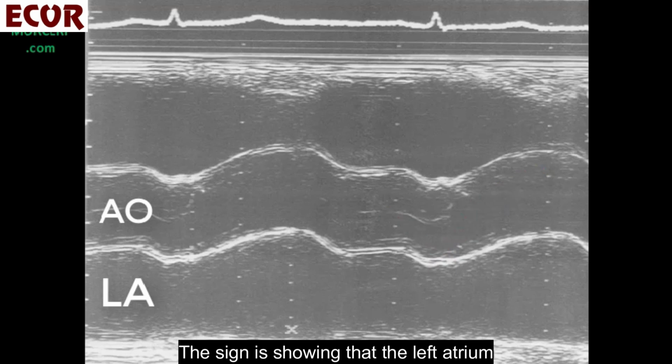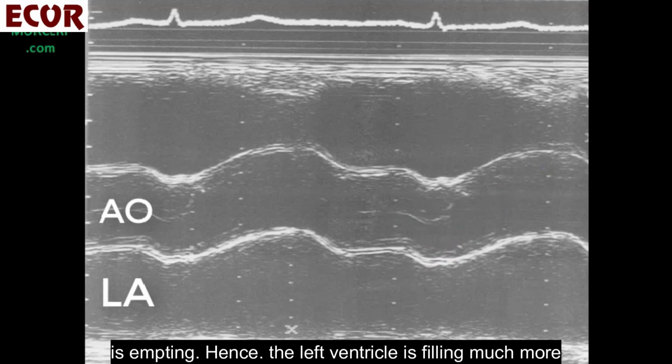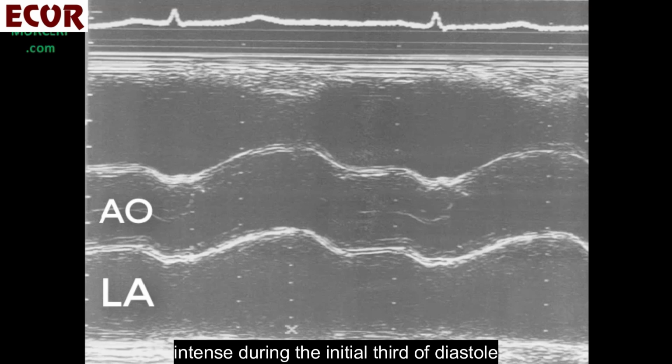This sign shows that the left atrium is emptying, hence the left ventricle is filling, much more intensely during the initial third of diastole than in the late two thirds.